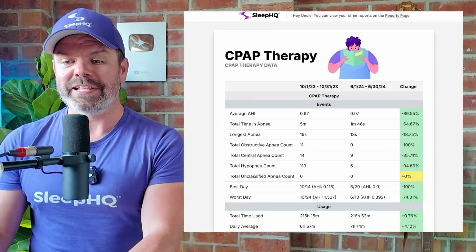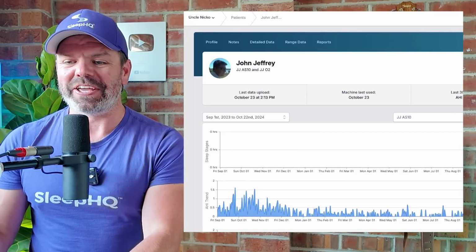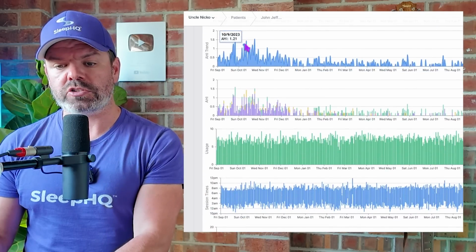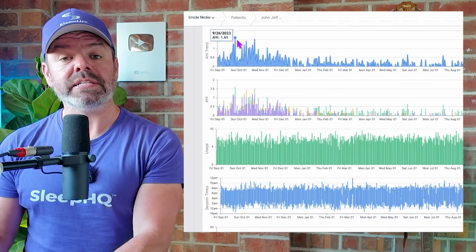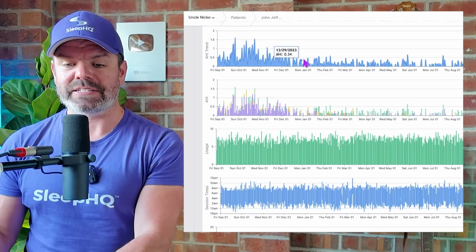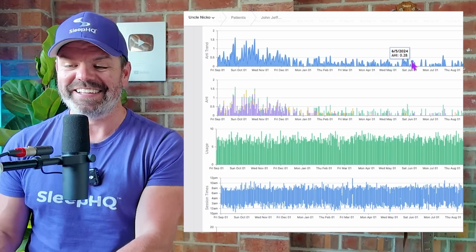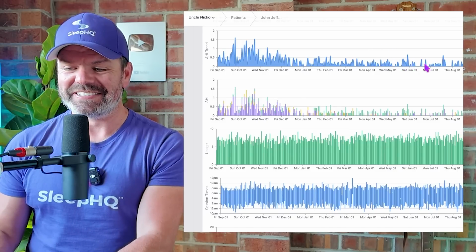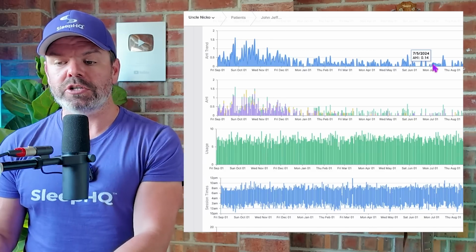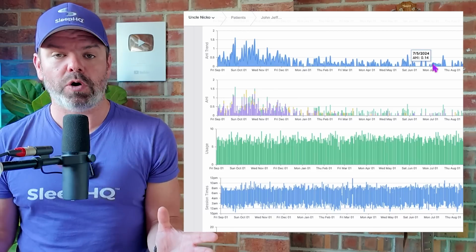Now, just before we go, let's check out the trends. All right, where are the trends? Here we go. Here's the trends. So here we have the apnea-hypopnea index trend, how many events he's having per hour, and it's trending down. All right, he's got it down to less than 0.5, and it's been that way. It's still improving. So good. Look at this. You know, it's down here at 0.14 now. Just incredible results. Jons' AHI was never high to begin with, and that's the point of this whole video.